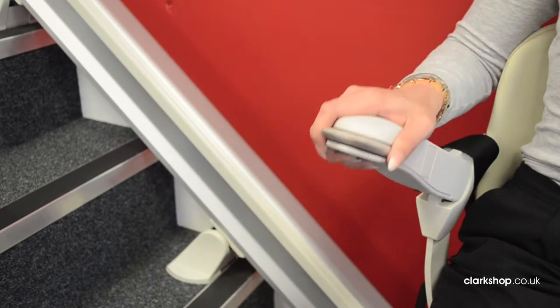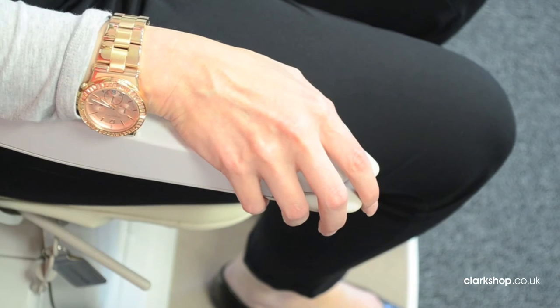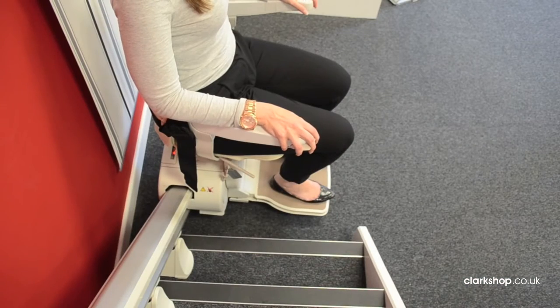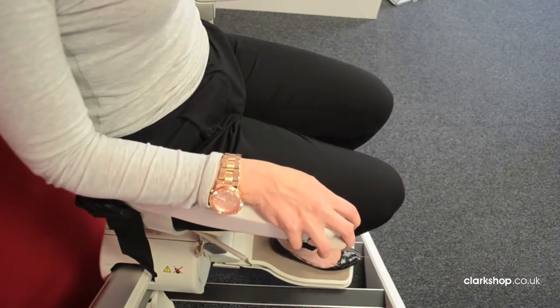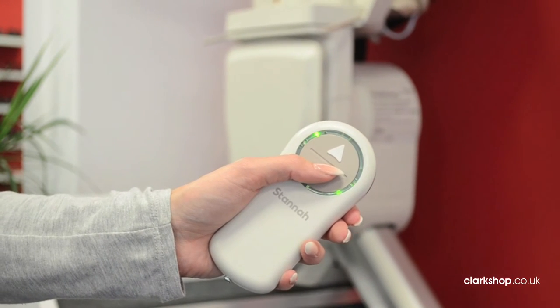The controls are located on the armrest which you can use seated and while the stairlift is in motion. The control is pushed to the left or right depending on whether you want to go up or down. There's also a handy remote control that can be mounted onto the wall.